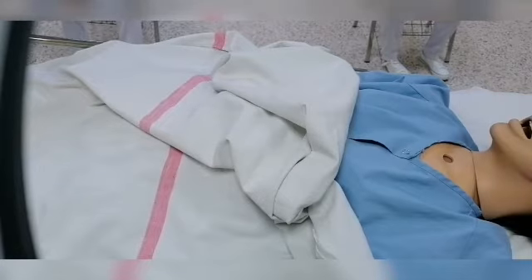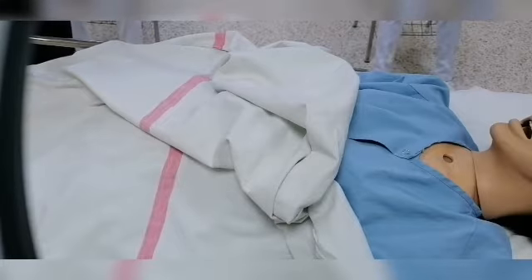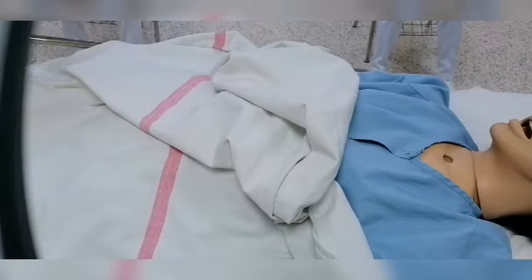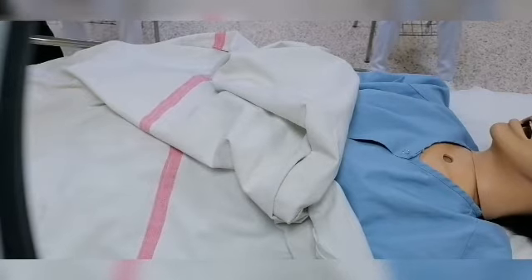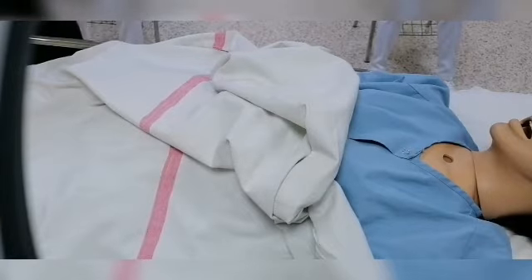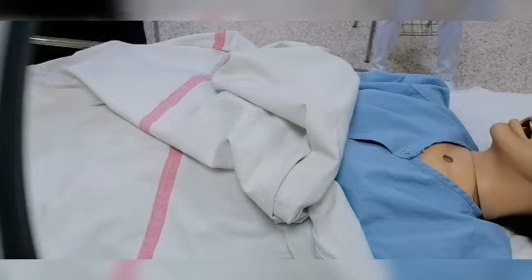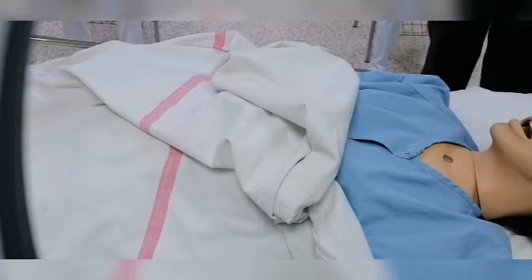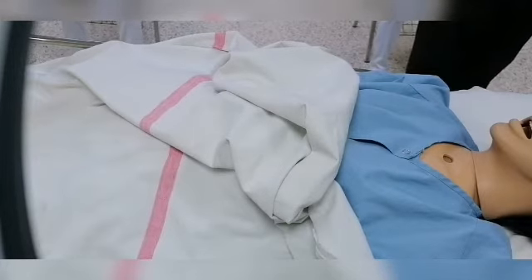Before any procedure, you will either verify the need from the client chart, or assess the need of the procedure according to your assessment of your patient. Those are the basic steps for any procedure. You have to verify the need for the procedure, then prepare your equipment. For the dressing, we have to prepare the dressing set.